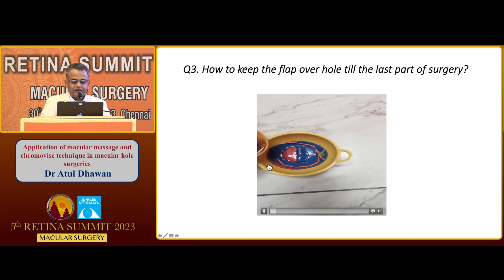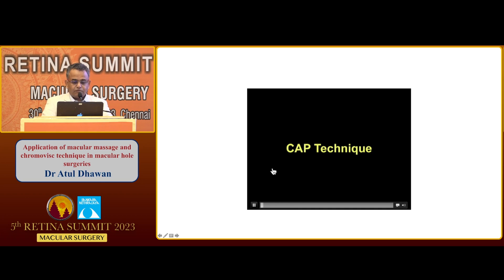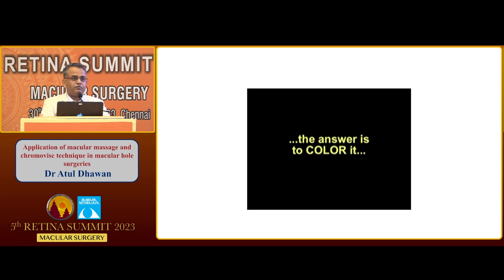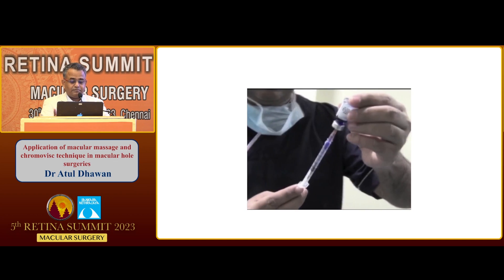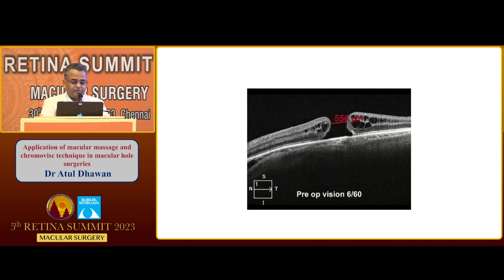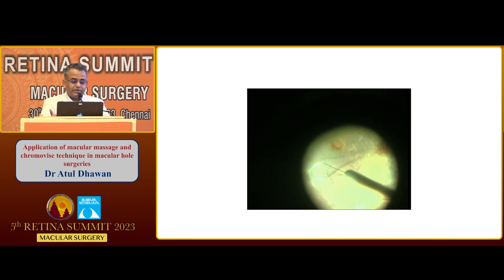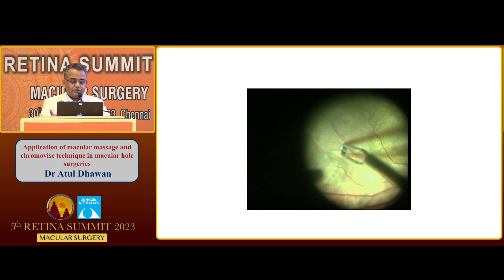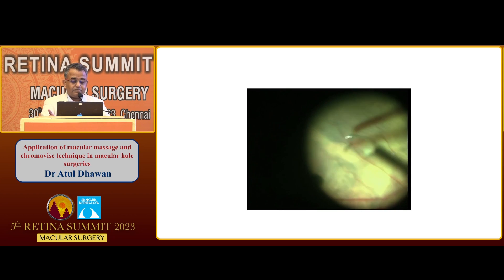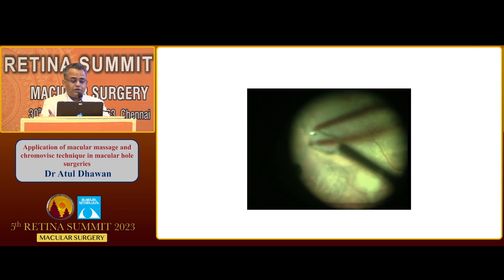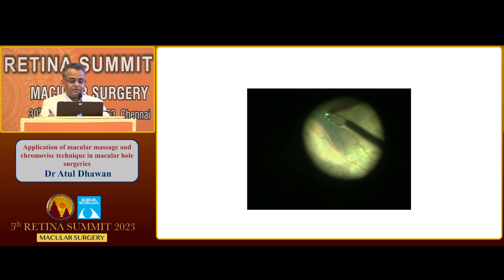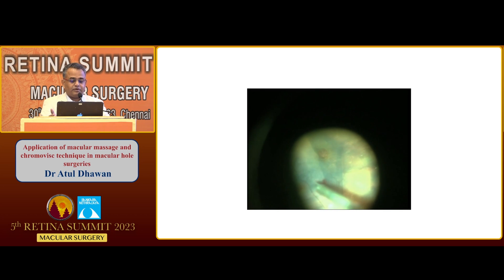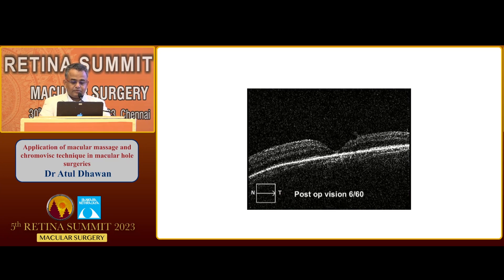Now we'll take a real video. CAP is the colored visco-assisted ILM flap technique. We color the visco with one drop of brilliant blue — the same brilliant blue used in macular hole surgery. This is a 180-degree ILM flap for a 550-micron hole. Just make the flap with an initial cut using a finesse loop, start peeling from one side, be very gentle, place the flap over the hole, and support this flap with the temporary colored viscoelastic. Later on, you can take out all the viscoelastic because of its blue color. U-shape closure is achieved.